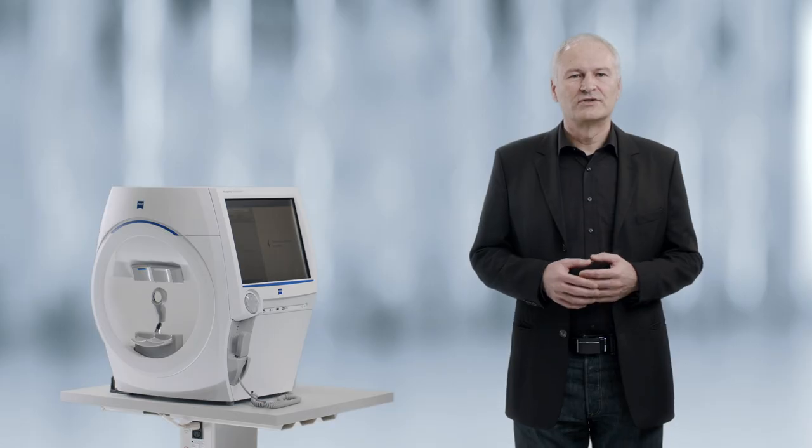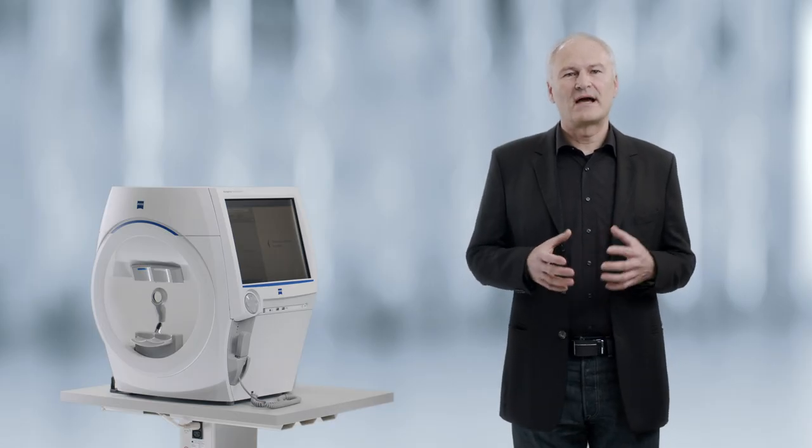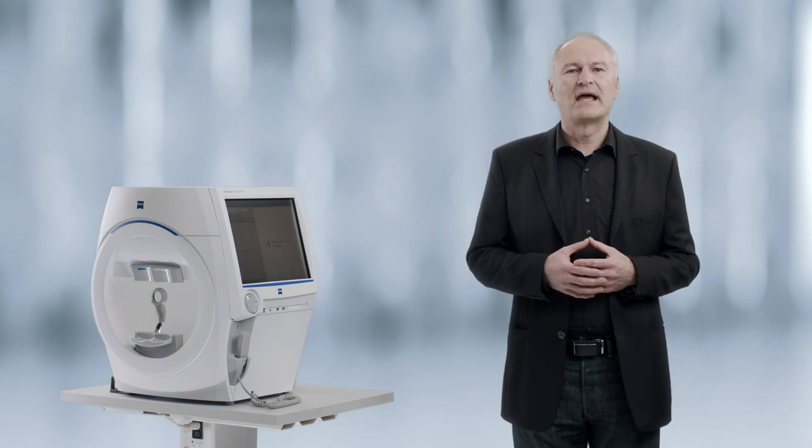Hi, my name is Tobias Winkler. I'm a regional manager at Zeiss Meditech. Today I want to show you how to set up a patient for testing at the HFA-3.